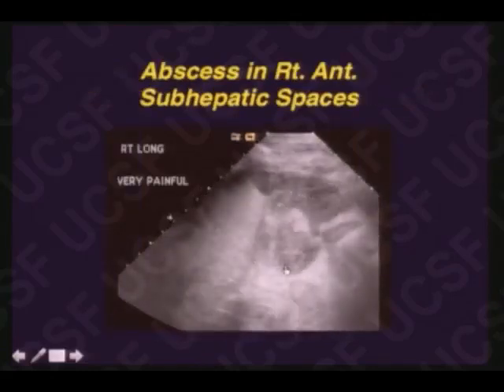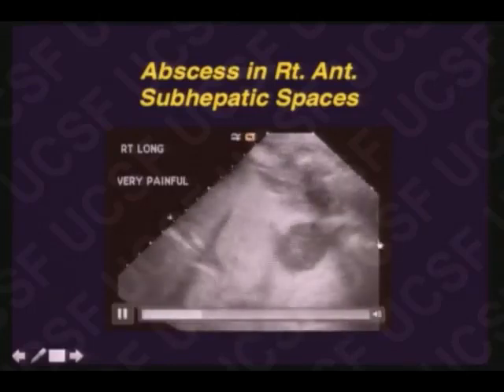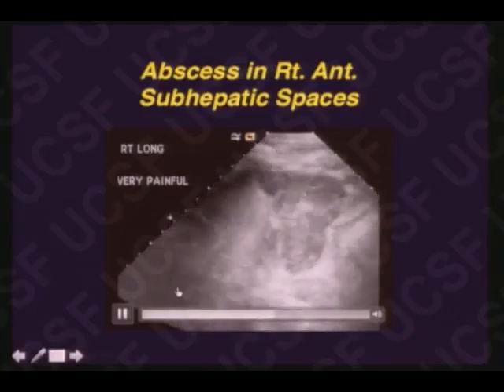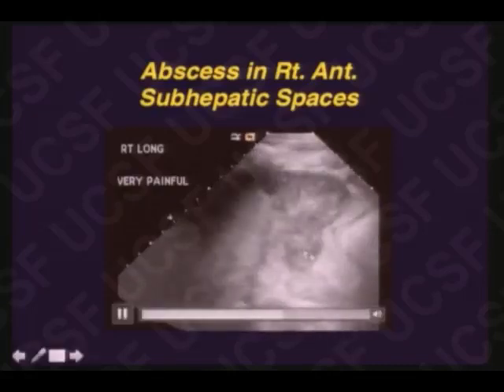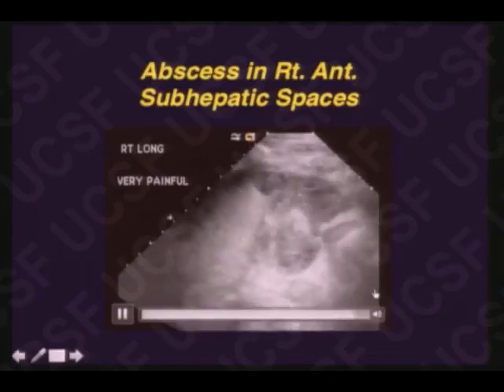Importantly again, gas in the duodenum, of which there is plenty in this patient, cannot stop me from finding this abscess in the right anterior subhepatic space. The beam must pass through that before it can encounter gas in the duodenum.